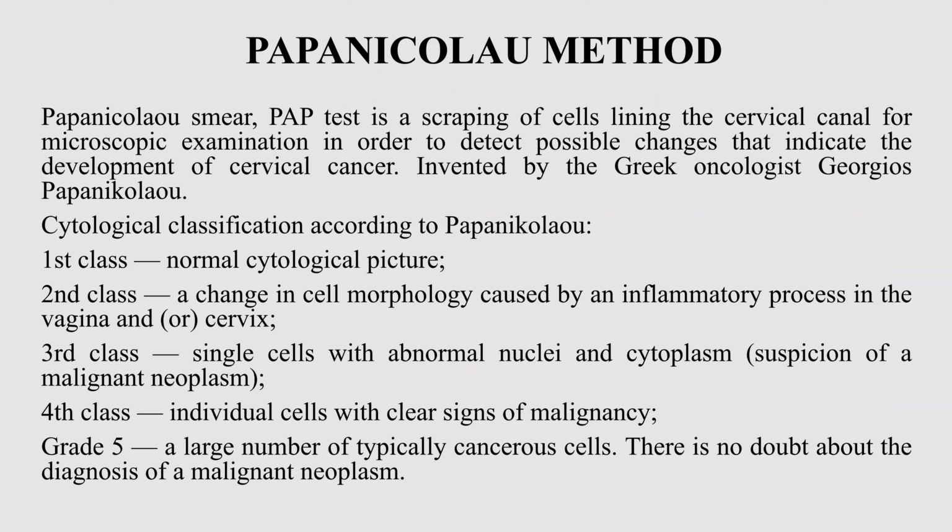But we surely investigate the nuclei of these cells and search for signs of atypia, search for inclusions inside the nuclei, look at the cytoplasm and compare with normal or abnormal tissues. It helps to evaluate tissue very quickly.